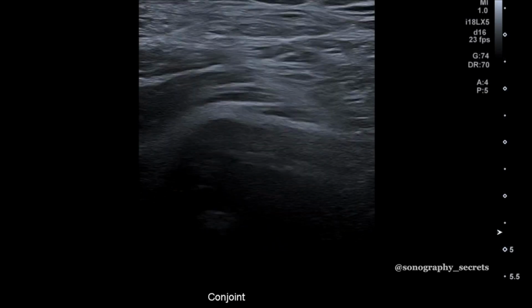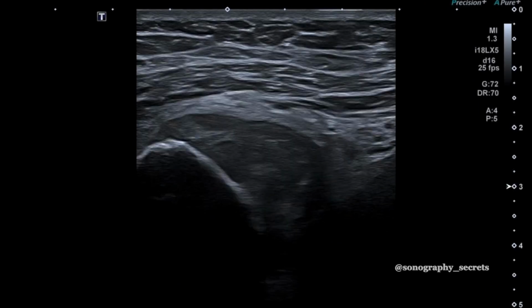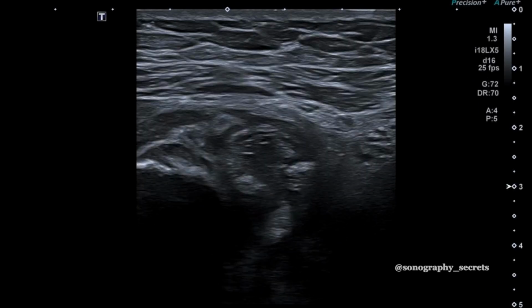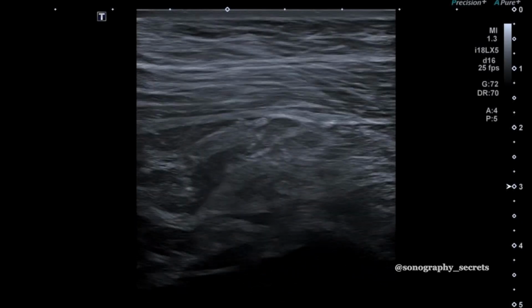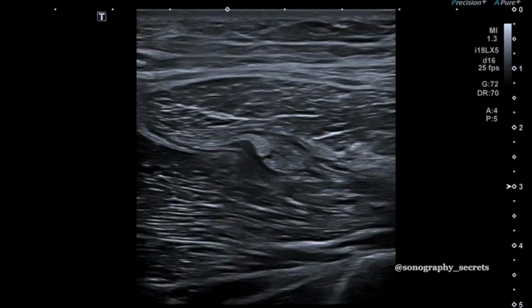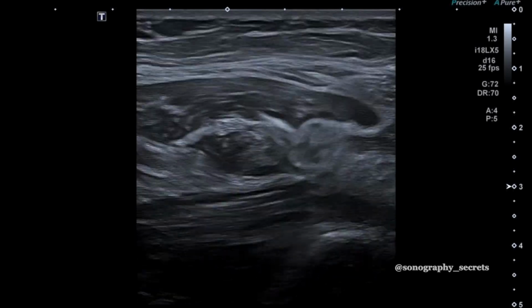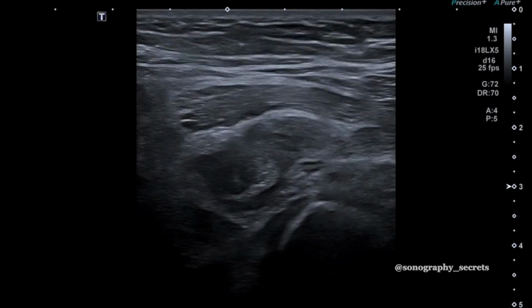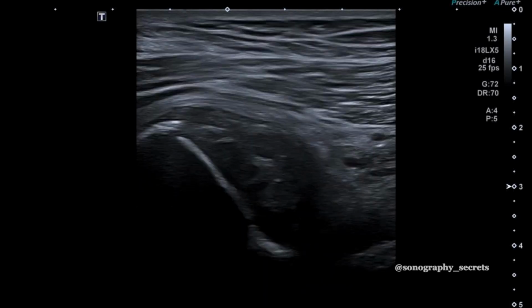We had some good questions at the workshop last week. One was regarding tendinopathy and being able to identify hamstring origin tendinopathy. So this will be like any other tendon. You'll get a hypoechoic, thickened tendon. Often you see a little bit of edema around there as well. Sometimes that origin can be a little difficult to assess on ultrasound.